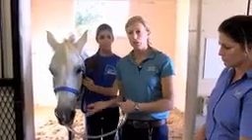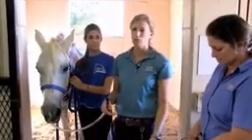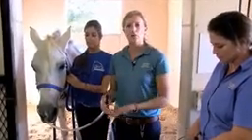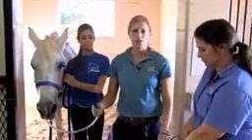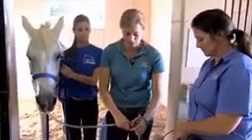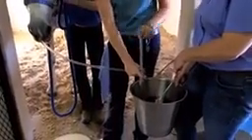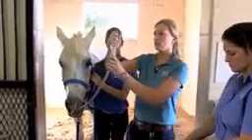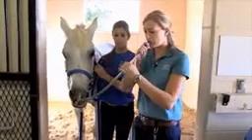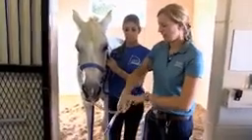But if you are concerned about colic or reflux and you need to lavage the stomach, you would keep going, and often you'll use 1 to 2 full buckets of water trying to get any of that sour feed or anything out of there. So in this case, I'm just going to give her a little bit more water just to simulate that I was giving her a medication. So I'm going to do a few pumps here, and then when I'm done, I'll just disconnect here. And then I'll just blow through the medication through the end of the syringe. Kink it off so nothing comes back, and then you can go ahead and pull the tube.